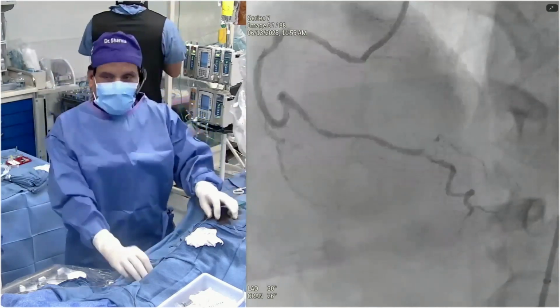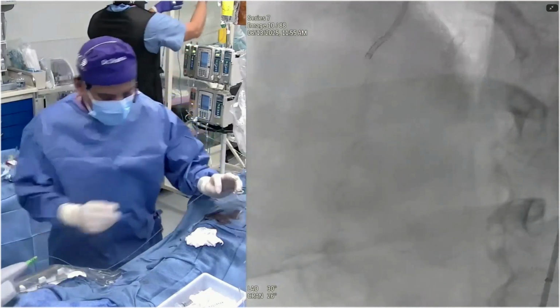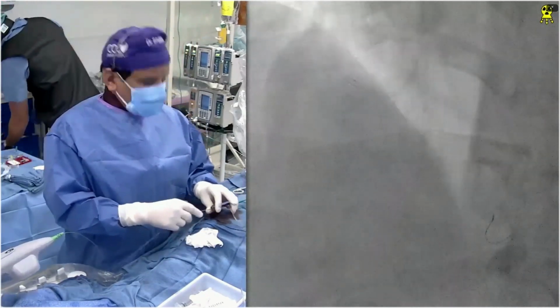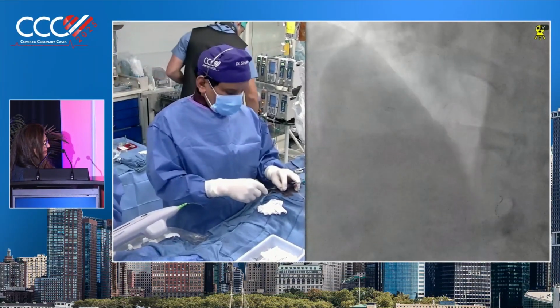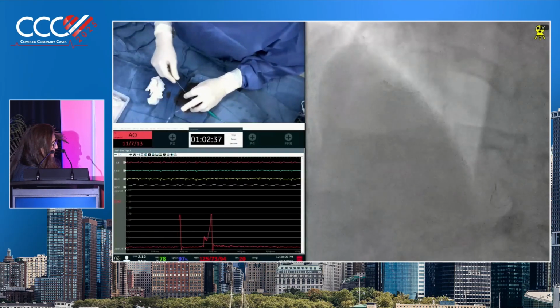So we are ready with the orbital atherectomy with a 1.25, and we have a ViperWire Flex, and we are going in. As you're going in, I'm going to ask this panel here, after Eclipse, where are you using orbital atherectomy, if at all? Sunil?